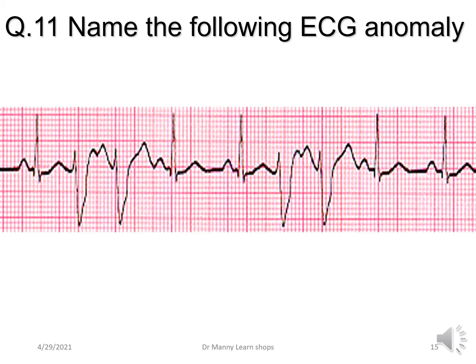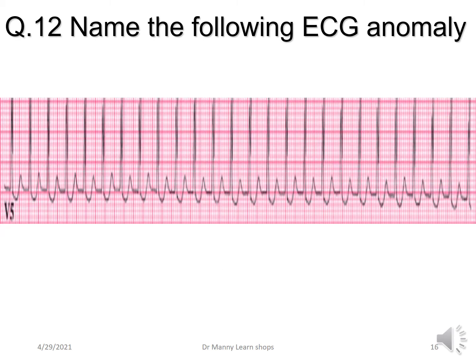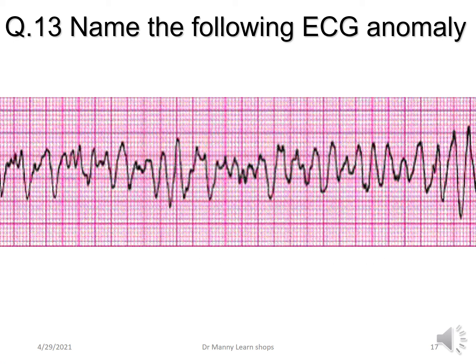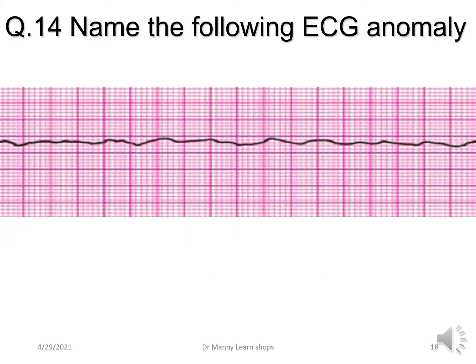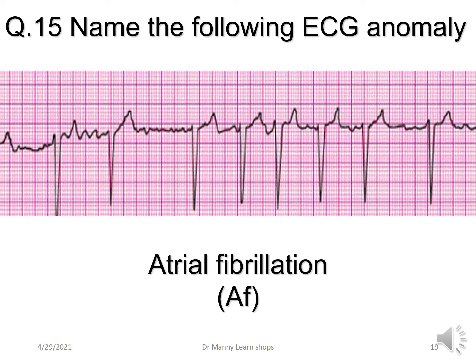Okay, let's see what you remember. What's the following ECG anomaly? Premature ventricular complexes. This one? Supraventricular tachycardia. How about this one? This is coarse ventricular fibrillation. How about this one? I'm sure all of you will get this — this has to be asystole. What about this one? This is atrial fibrillation with a controlled ventricular response.